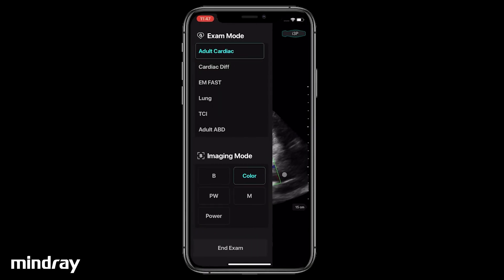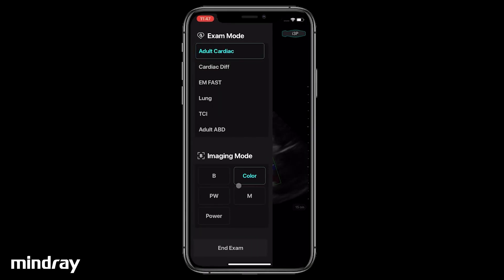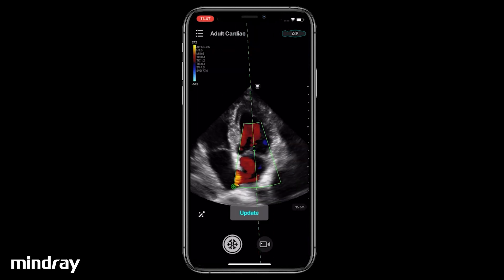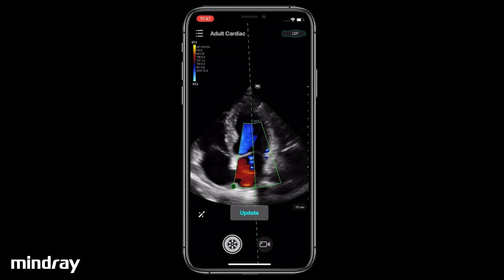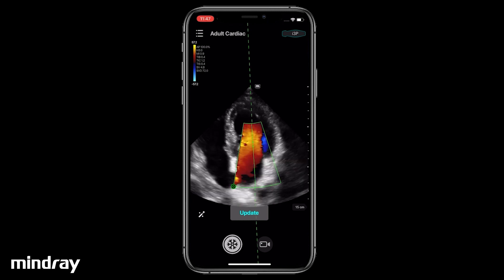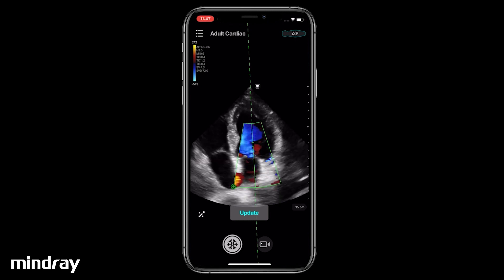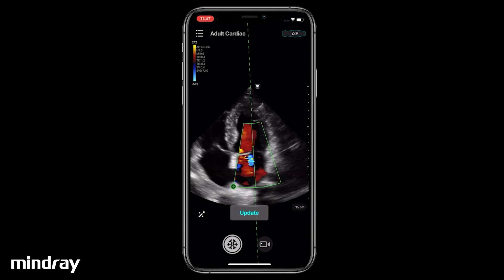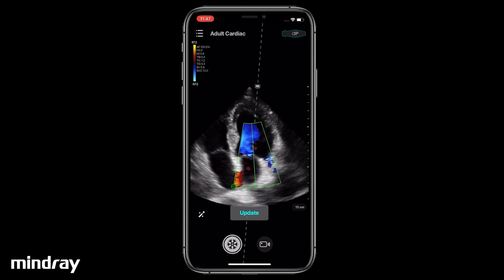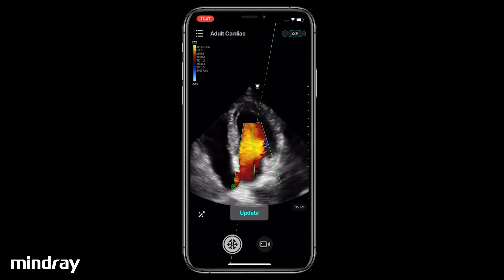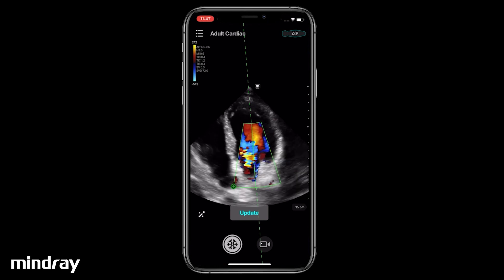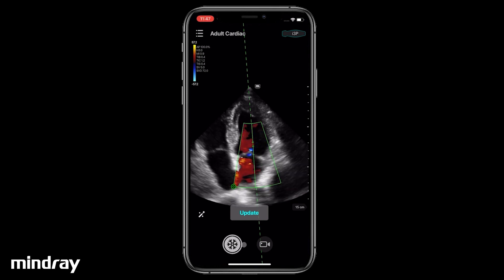Swipe the screen from the left edge to the right. Tap PW. Drag the sample volume to the target position. Stretch or pinch two fingers to resize the sample volume. Drag the angle correction line (dotted line) to change the sample angle. Tap Update.